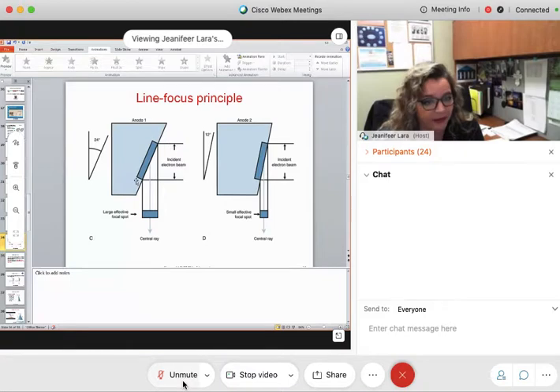By angling the target, what is going to emerge, Wani? What is going to emerge after the electrons interact with the target? Two things will emerge. What are they? Go ahead, Luke. Were you raising your hand? Oh, so sweet. Thank you.